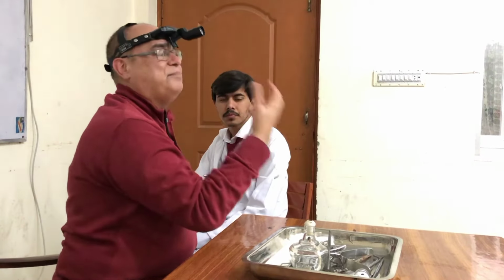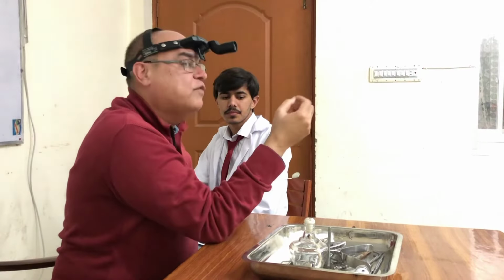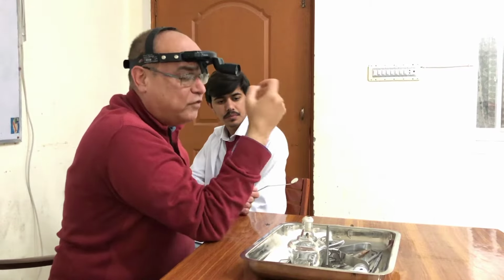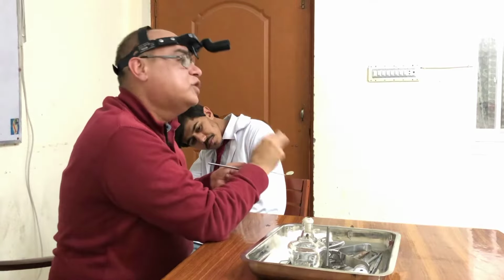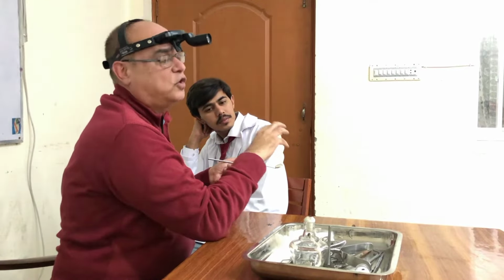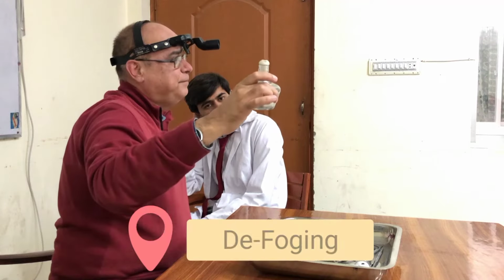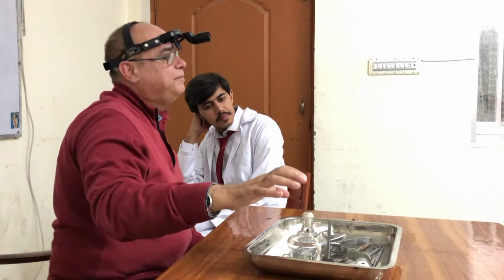During the procedure, the patient is of course breathing, so due to the breathing this mirror will be fogged. To avoid that fogging, we have what we call anti-fogging solution. If we have that, just put one drop here so that the mirror will not be fogged. If that is not available, then you have to use this conventional spirit lamp. You will light it up and warm this mirror from the mirror side.